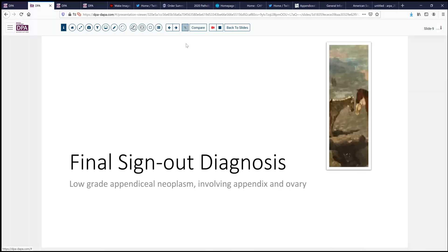Our final sign-out diagnosis today is low-grade appendiceal neoplasm. This involved the appendix and had spread to the ovary. So that particular caveat is present: even if you don't see direct perforation or invasion, if you have this sort of low-grade appendiceal neoplasm and similar tissue in the ovary, it is presumed to have arisen from the appendix and treated accordingly as locally disseminated disease. That is an important thing to remember in terms of management and diagnosis.